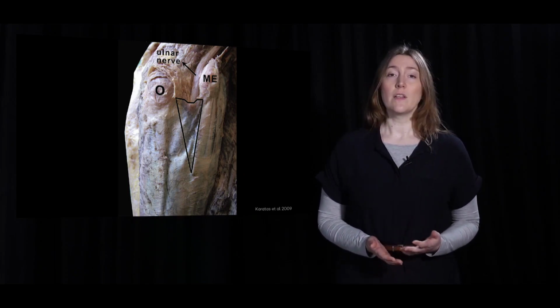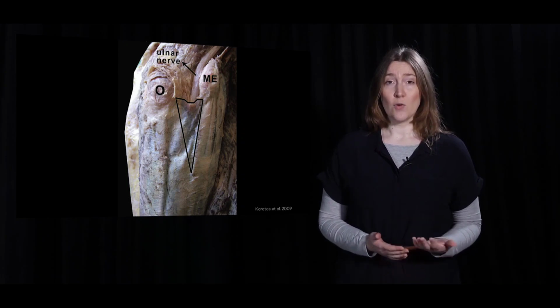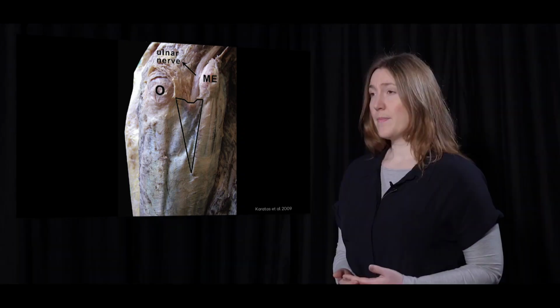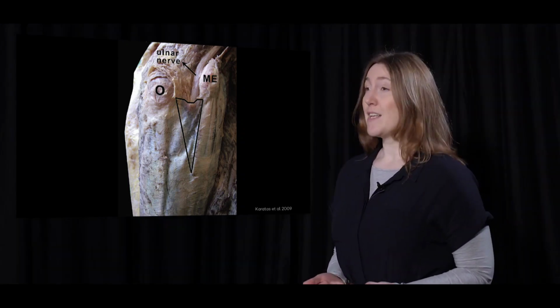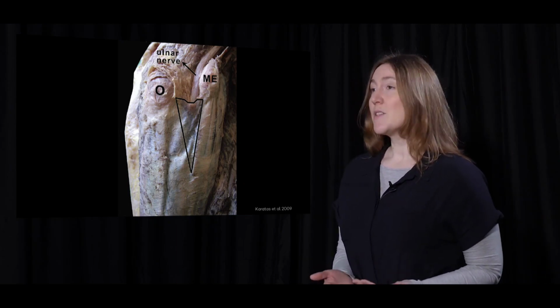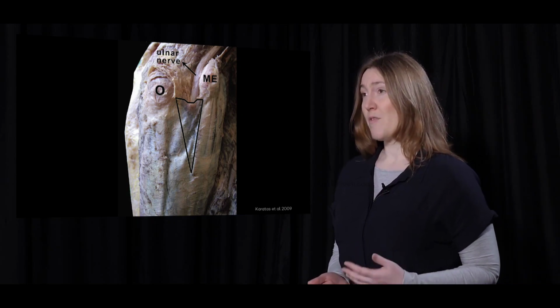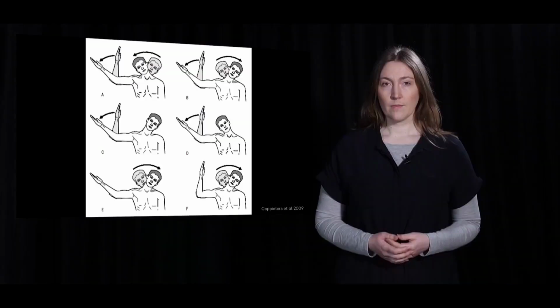If we follow the ulnar nerve distally, the nerve courses into the depth between the forearm muscles. Since this is a much less vulnerable spot, the muscle protects the nerve. There is no surrounding fat anymore, and the ulnar nerve has a more hyperechoic appearance.